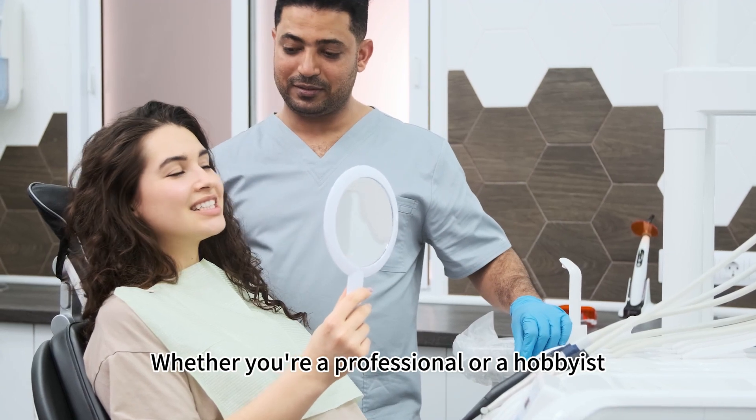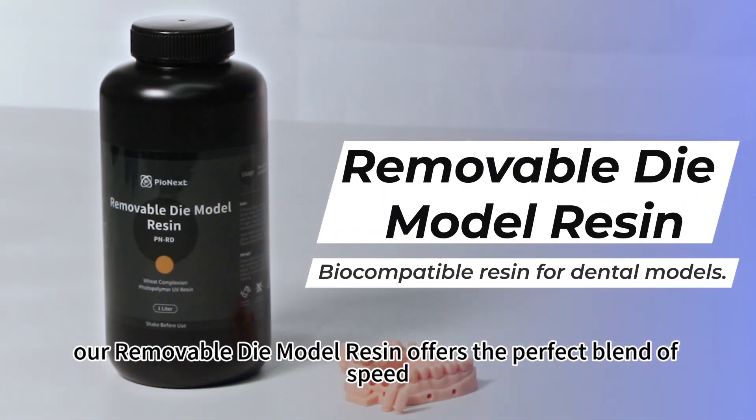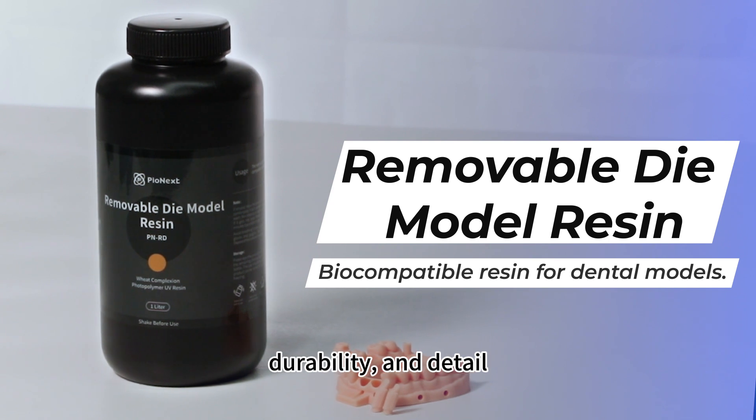Whether you're a professional or a hobbyist, our removable die model resin offers the perfect blend of speed, precision, durability, and detail.